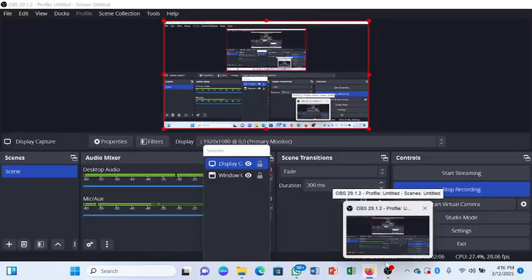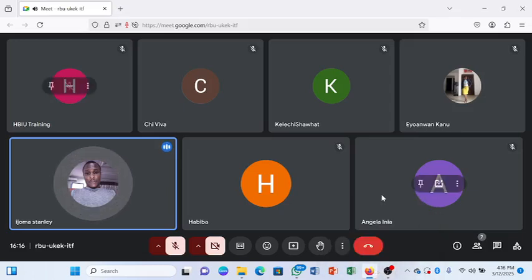Then during sample collection, the things you need to be aware of include wrong order of draw. Wrong order of draw, that's if you're taking the sample appropriately. Then extended tourniquet time, that the tourniquet which you tie to make the veins pop out, you don't leave it for a very long time. Because if you leave it for a very long time, you might not collect blood in its natural form.